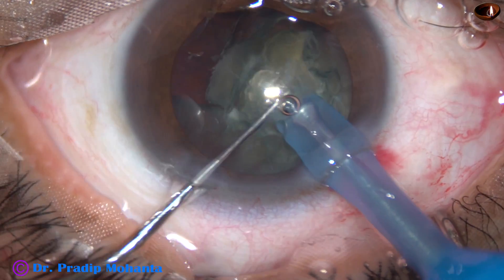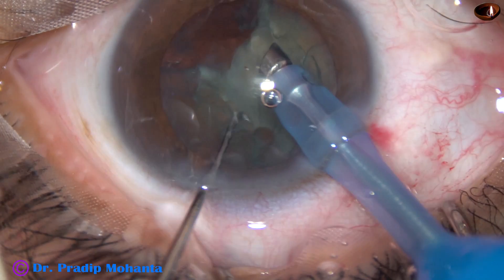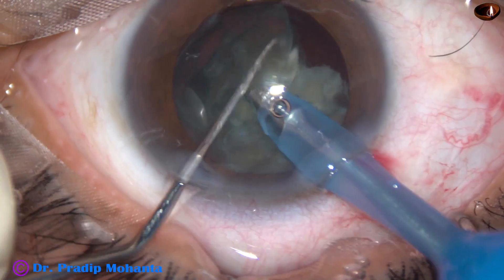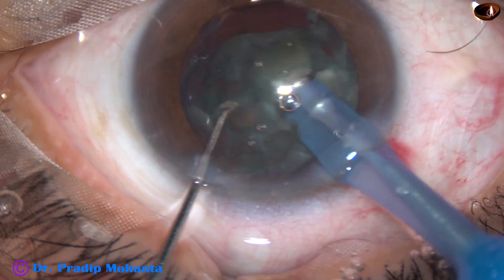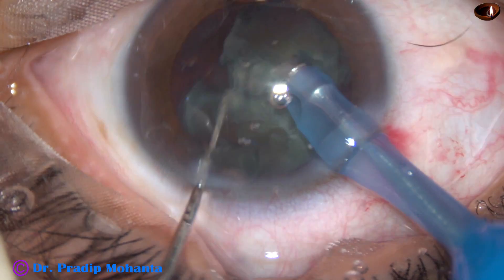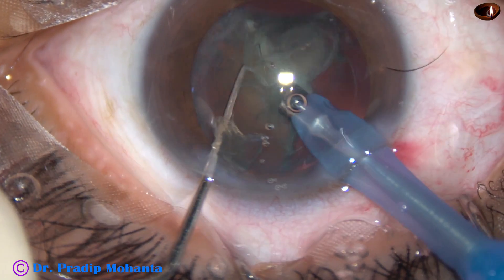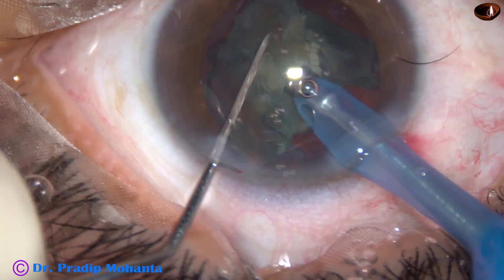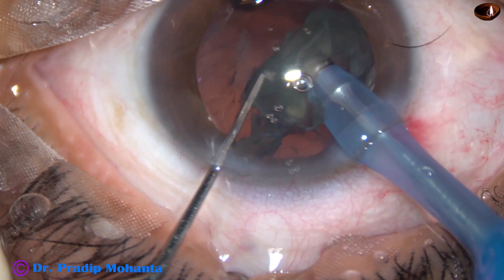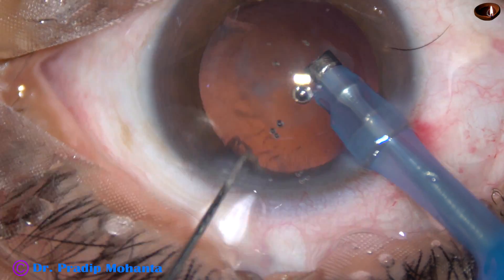The free nuclear fragment is emulsified and engulfed. This is another piece — it is also emulsified and removed. Now, this is the other hemi-nucleus, which is chopped into pieces. Phaco power used in this case is 65%, flow rate is 45 ml per minute, and vacuum is 450 mmHg. This is the last portion of the nucleus, and this is the epi-nucleus. See the followability of the machine — beautiful.